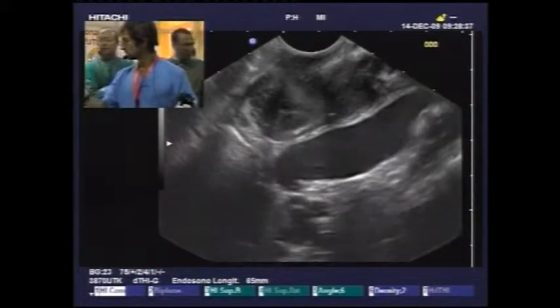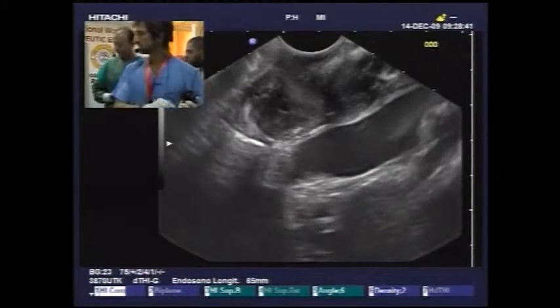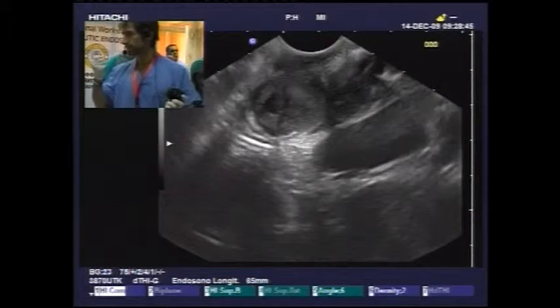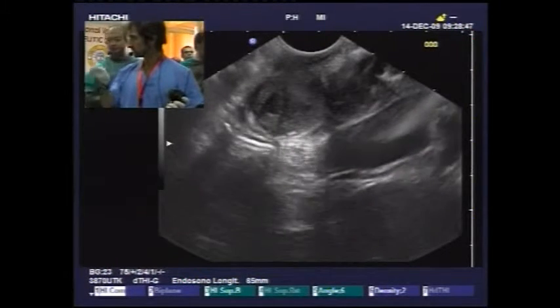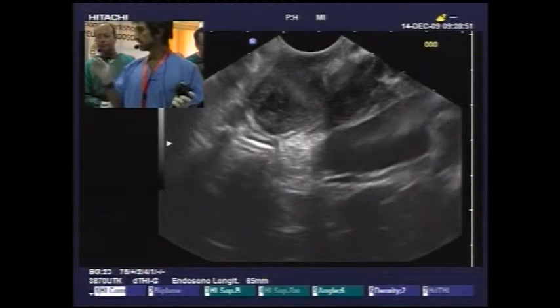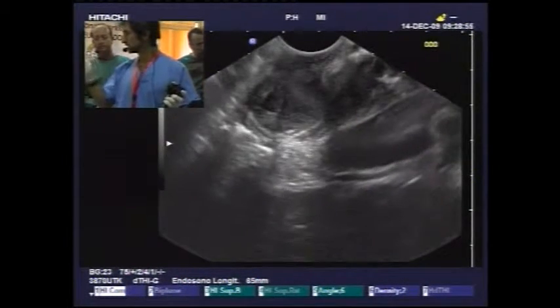You know that the lymph nodes usually are very bloody. So if I go on and through and out with the lymph node, the blood is what I usually find.